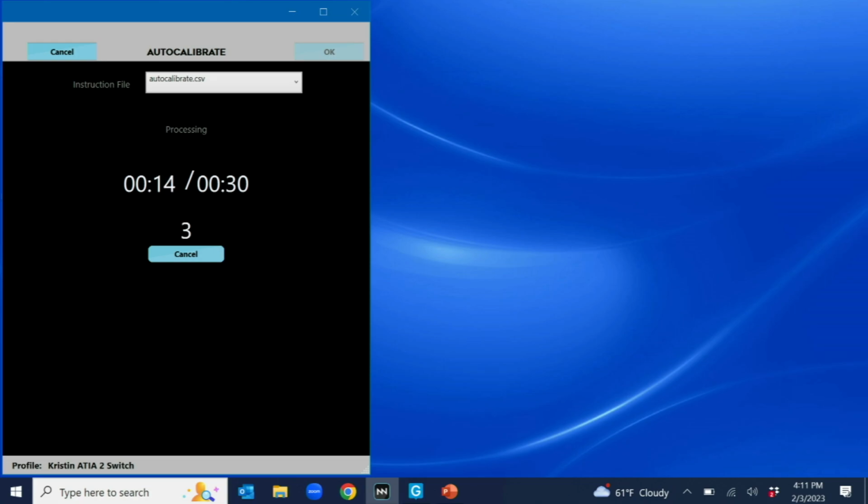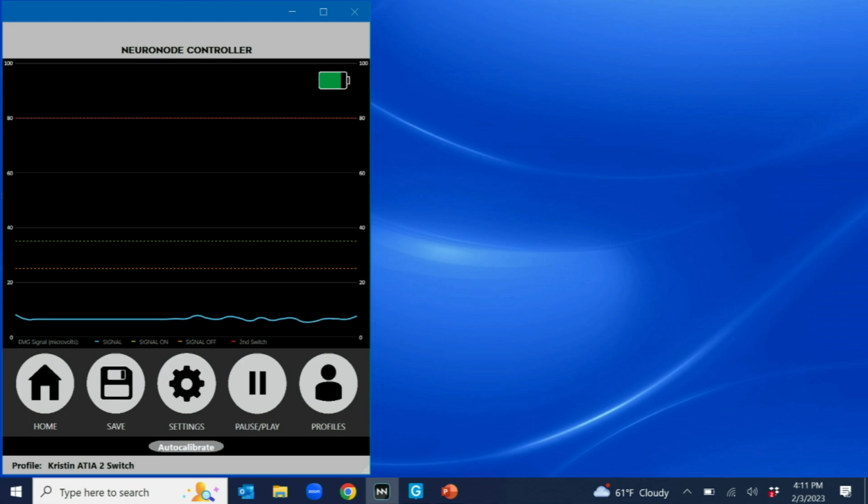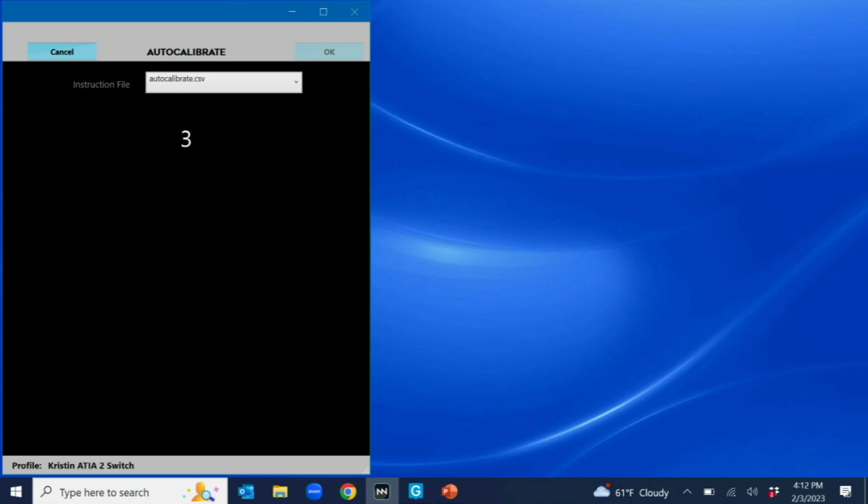And this is part of the reason we do this, because we want to make sure that the software is meeting the person where they're at instead of trying to tell the person to change to meet what the software can do. All right, one more. Perfect. Now, it did not like that either. Can I try another finger? No, that's the right one, and you were getting activations here, so I think just do a faster movement. All right, so we're going to try it one more time. This is what happens when you do live demos. Sometimes they go right the 3rd time. So we're going to do that. Okay, so there we go.